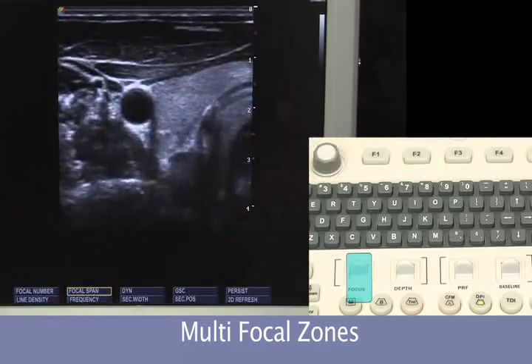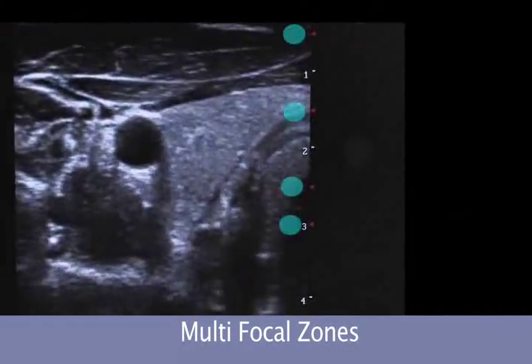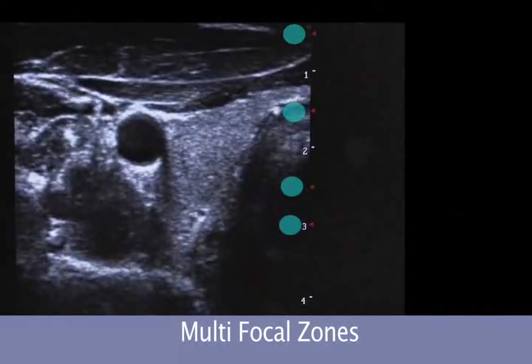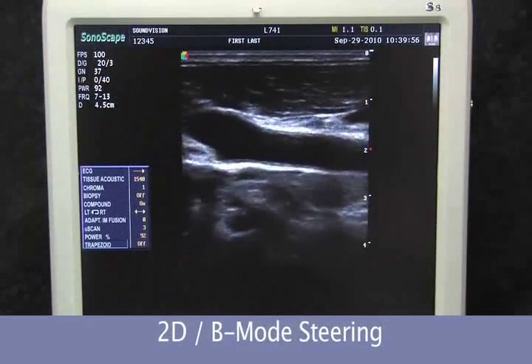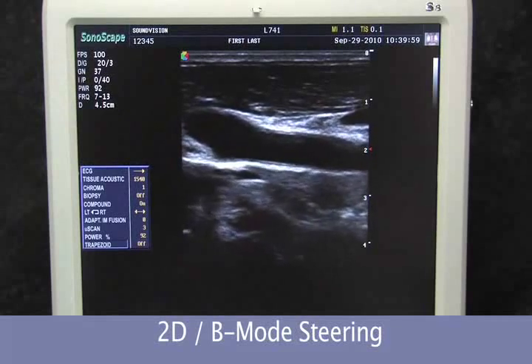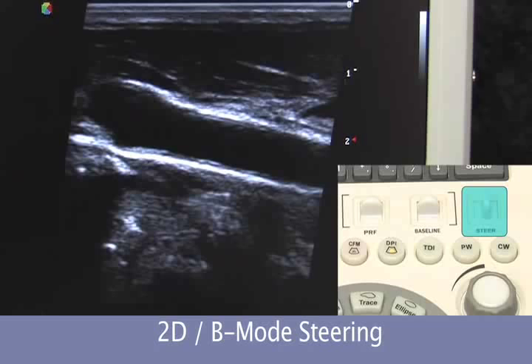Now I can take my focal zones across a broader range of the image. Additionally, the system has the ability to steer the two-dimensional image to take better advantage of perpendicular structures. Here we can see the vessel is diving away from us, not giving us an optimal angle of interrogating the far lateral wall. We're just going to steer, dramatically improving our definition of the intima.